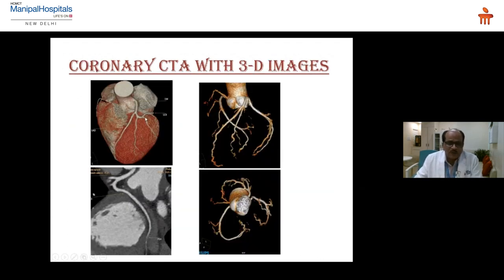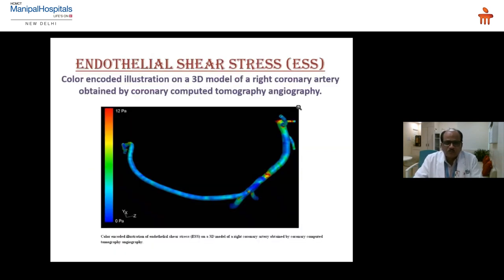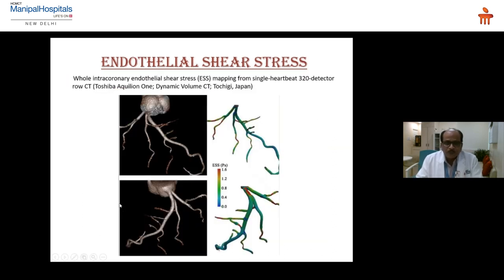These are three-dimensional images of the heart showing coronary arteries, providing excellent 3D volume data for ESS measurement. Various data shown in Pascals: the normal value of ESS is 1.5 to 3 Pascals — beyond that is high, and below that is low. This is the left coronary artery with color mapping showing how ESS can be calculated and visualized as a color map for measurement.